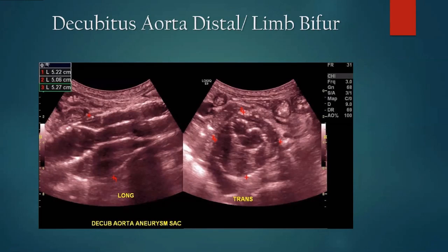So here we have the use of the chroma map on a decubitus image of the aorta, and you can see this study is at factory setting. Honestly, it's a beautiful preset. This is honestly a great patient. We're only about 4 to 5 centimeters deep. But changing your maps and being aware of your dynamic range is really helpful.